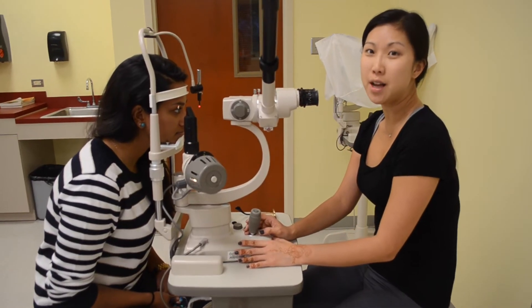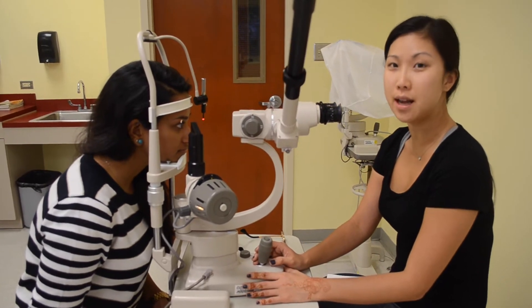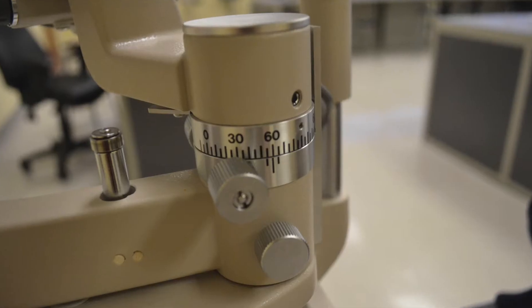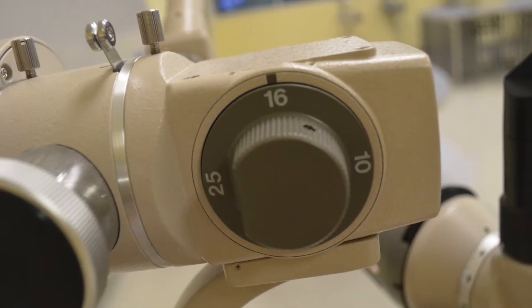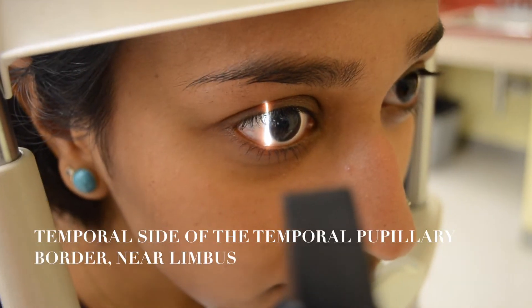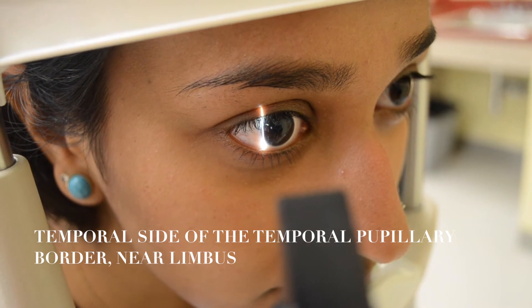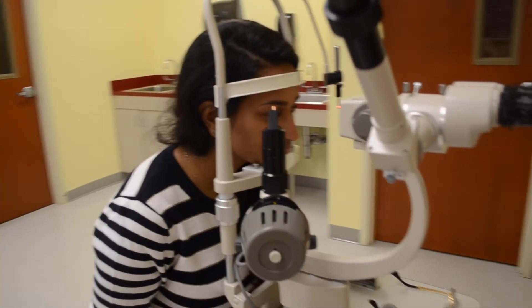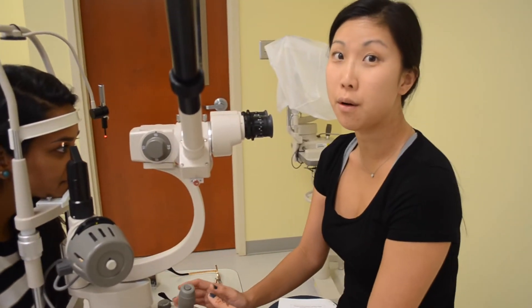So I'll be evaluating the anterior chamber by using the Van Heerick technique. I have this slit lamp here at 60 degrees, magnification at 16, the optic section near the limbus. This is gonna help me determine if she's a grade 1, 2, 3, or 4.